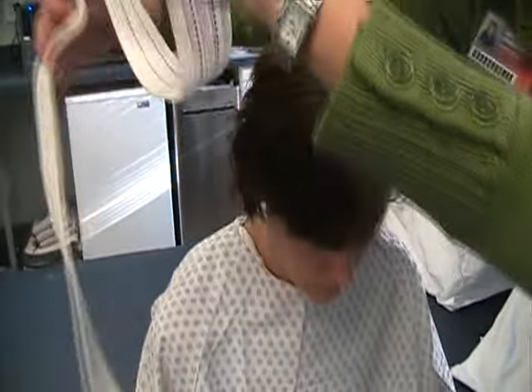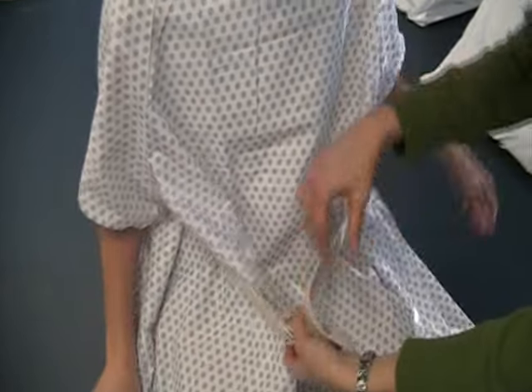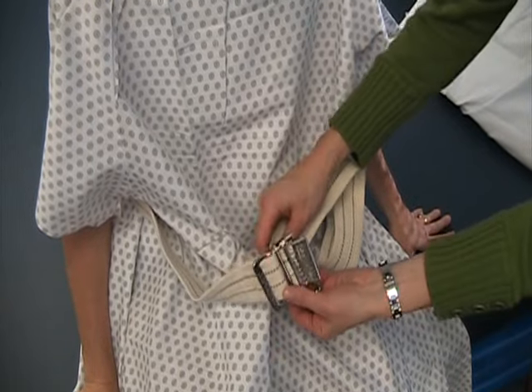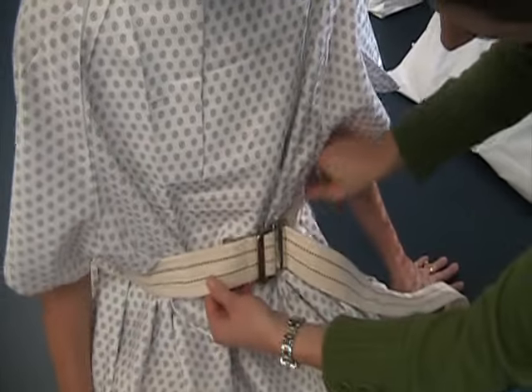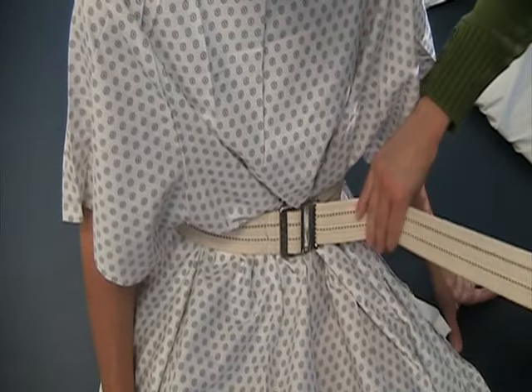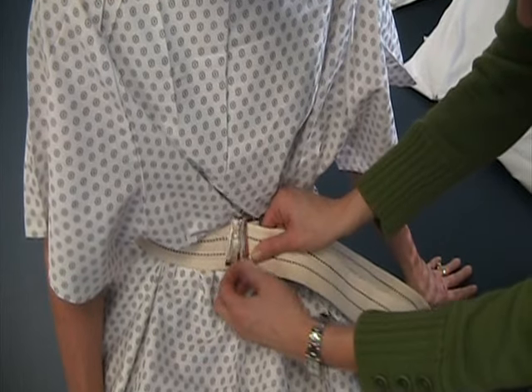When putting it on a patient, keep in mind that there should be no lines or tubes crossed in the lower abdomen. The belt comes through and should be pulled very tight, but not uncomfortable for the patient, and then threaded back through the belt.